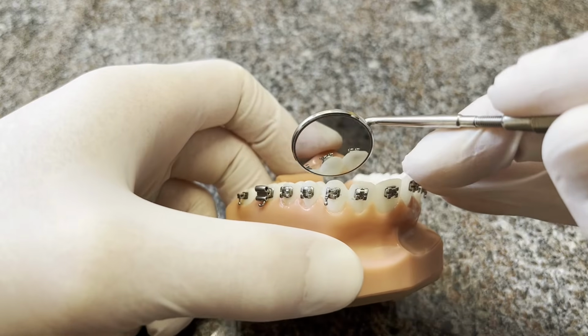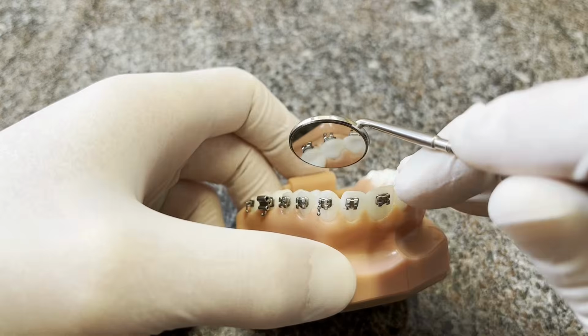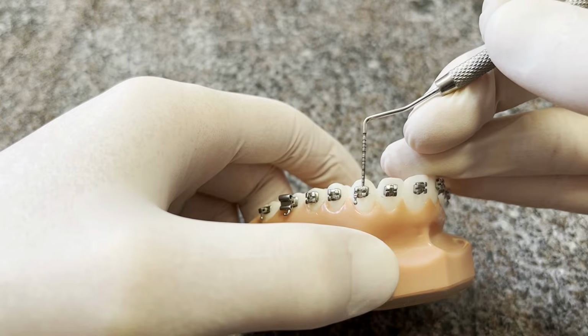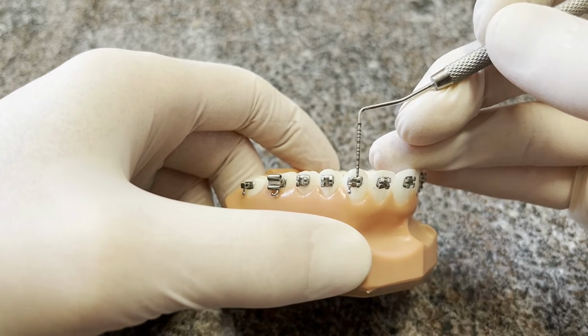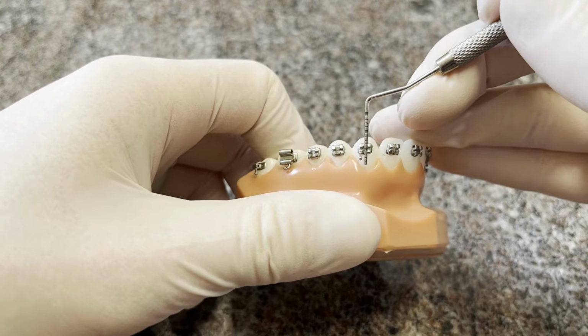You'll check it from the occlusal to check the rotational position of it. And on these, you want the height. I'll measure the height of these like this. You want the height generally to be about at the top of the 2 millimeter mark, which this one is pretty darn close. That's about where you want it height-wise. And make sure that it's parallel to the long axis of the tooth.